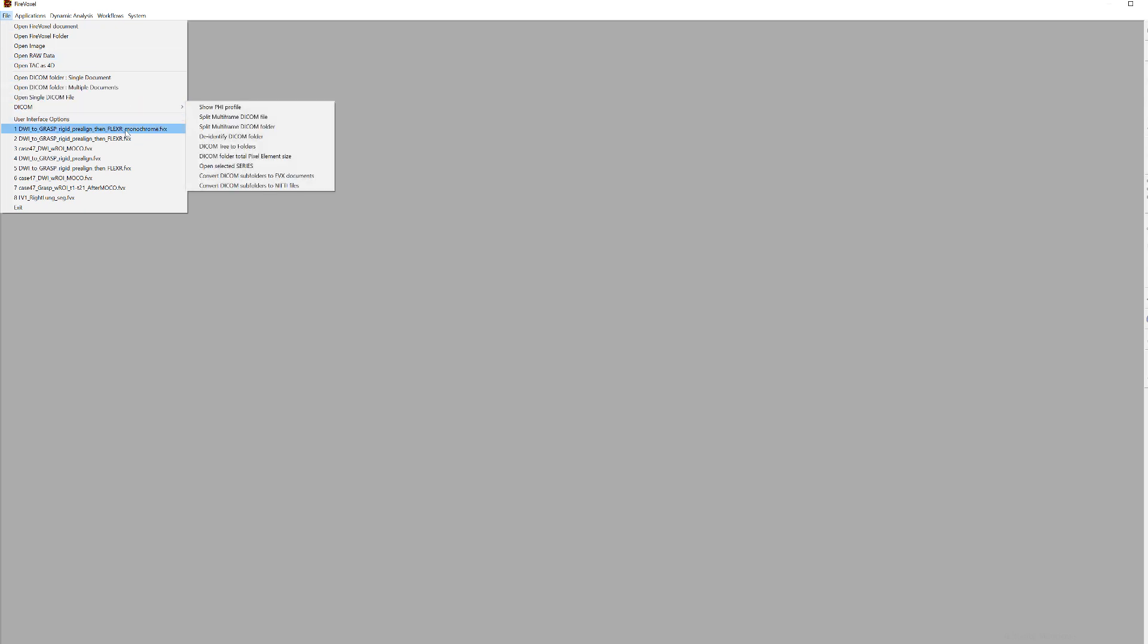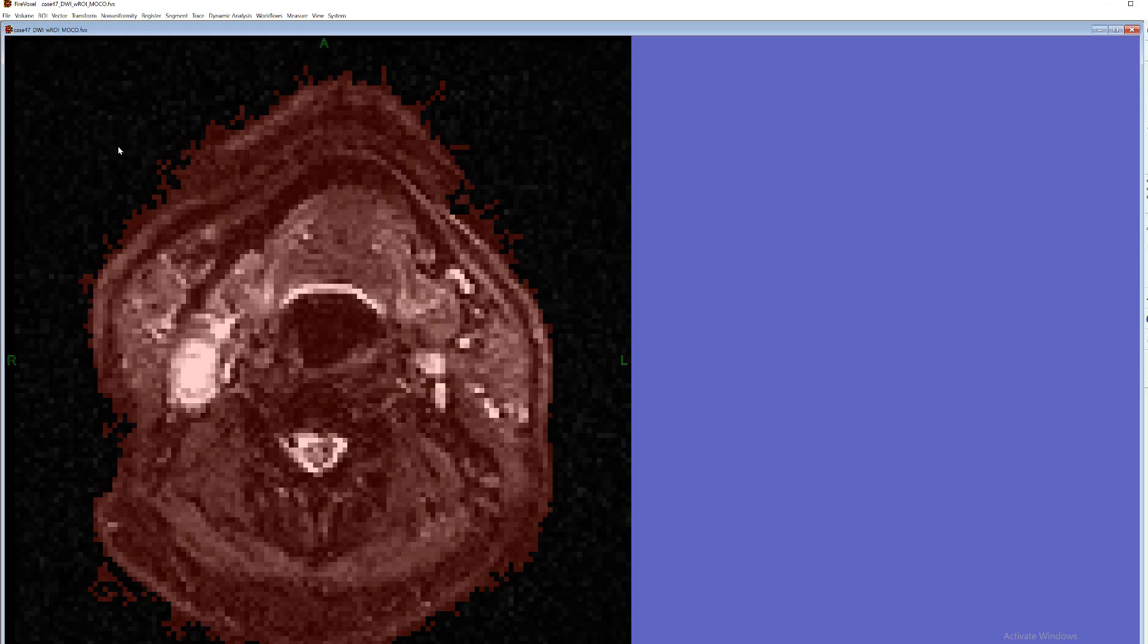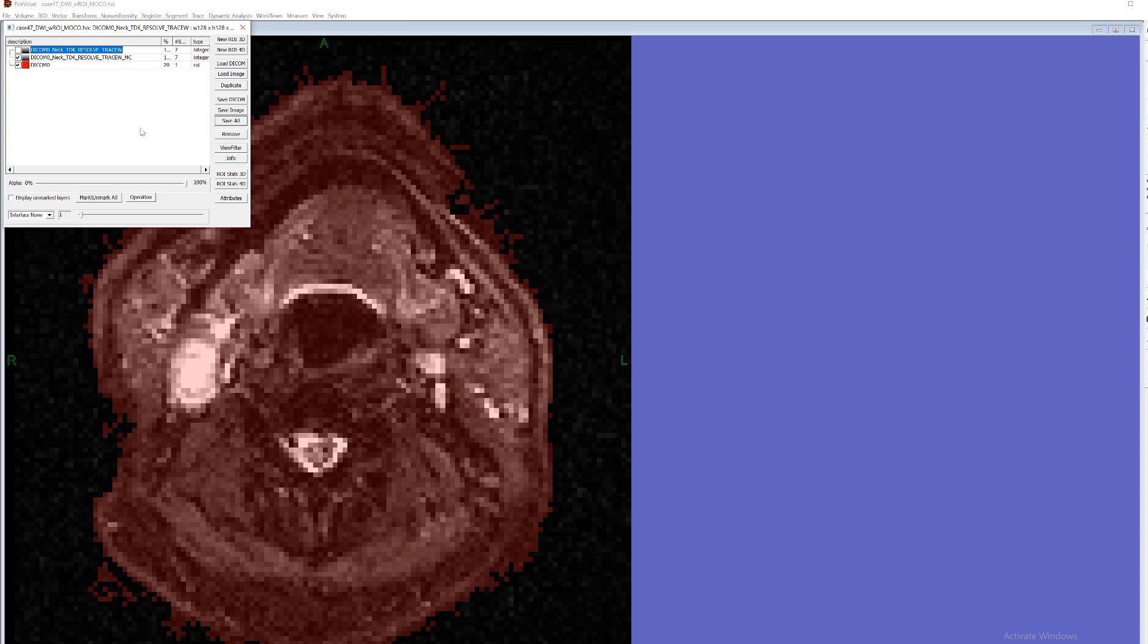So let's start with the motion corrected DWI volume. The first layer is unmarked and not visible. This is the original layer. The second layer is a motion corrected layer.